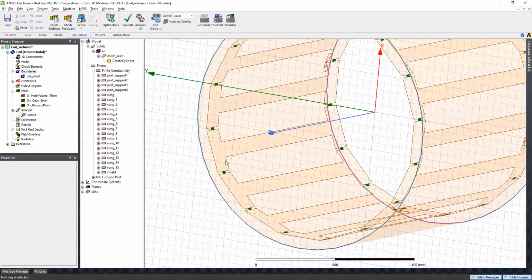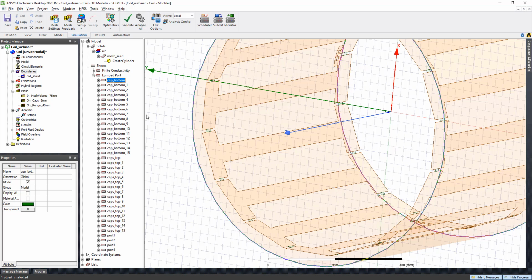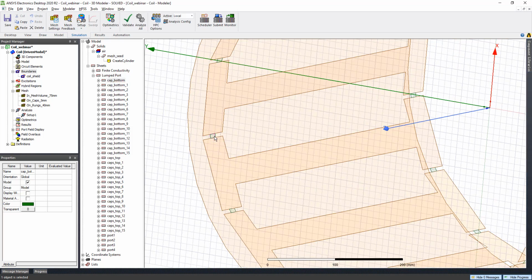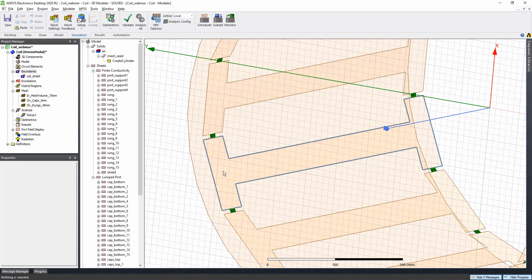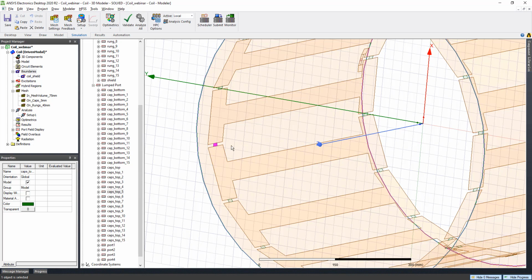And next, we have all the lumped ports. These are all the excitations. You can see here this is called cap bottom, cap top. This means they are the tuning capacitors here. At the beginning, we are not adding the capacitor values here because we are going to link this with another tool called Circuit Designer, and then we can add our capacitor values to it.